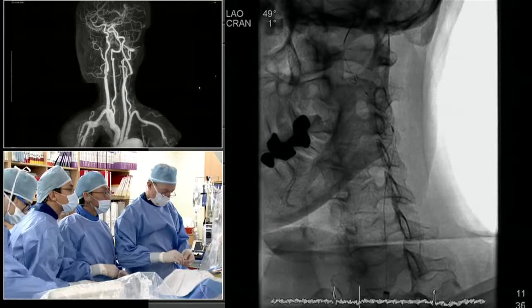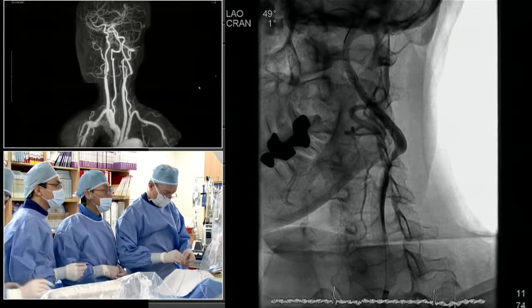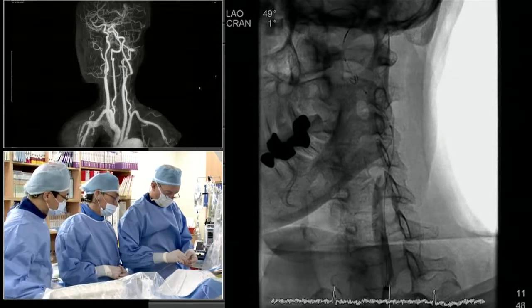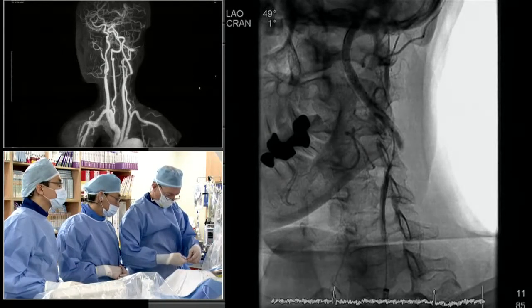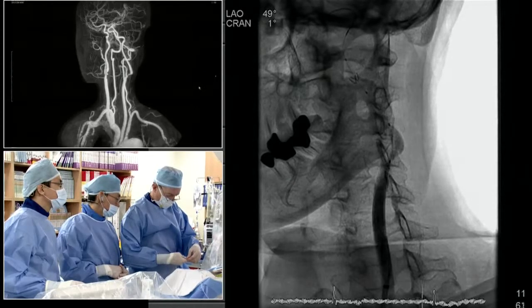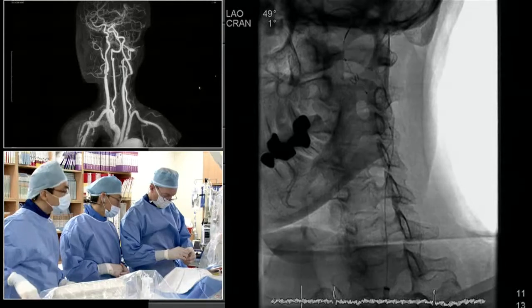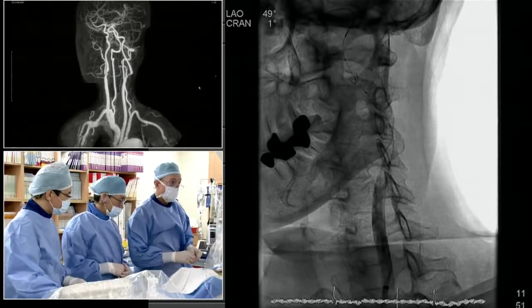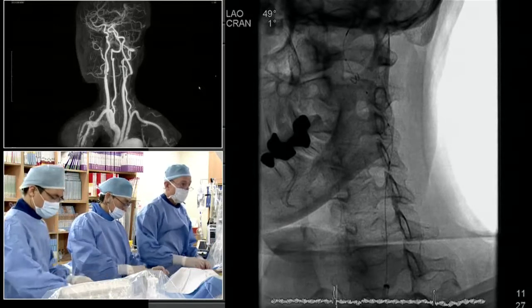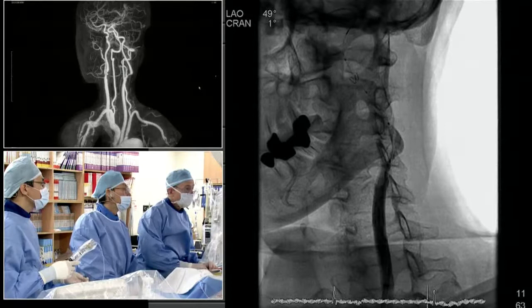We should have that angio up for you there. This is much bigger now. Is that a different magnification? I understand that this is after first predilatation, the balloon was too high. And did you take another one after the second predilatation? Yeah, then we brought the balloon down a little bit after we did one more inflation after that, again to nominal.